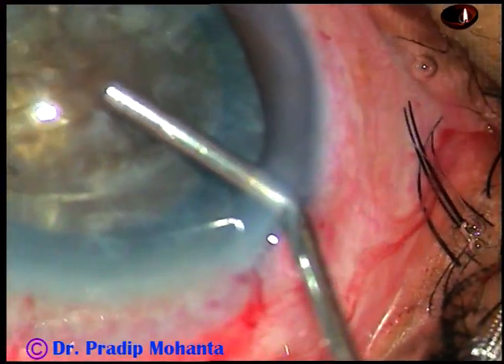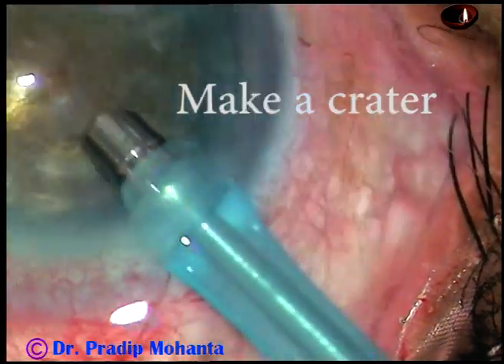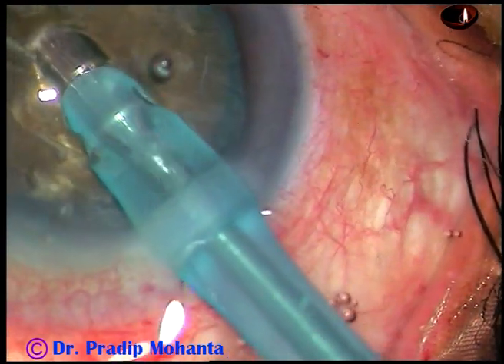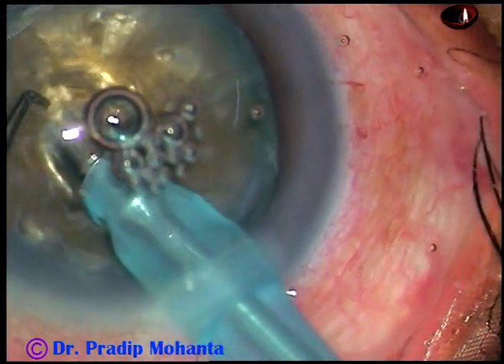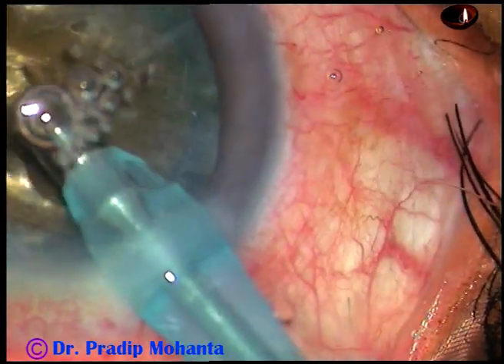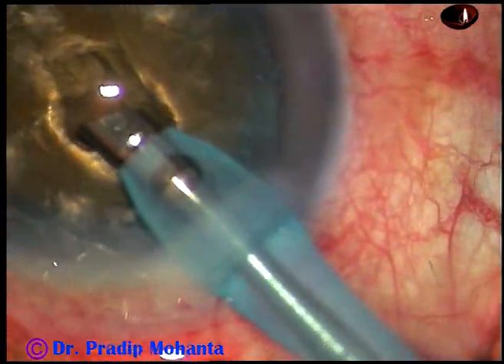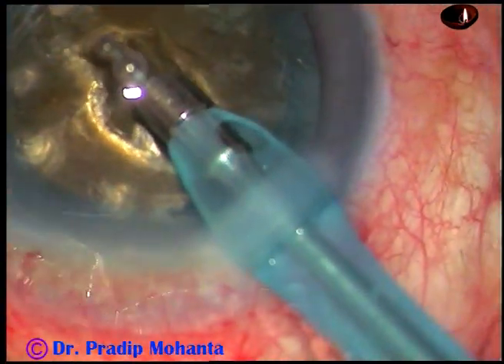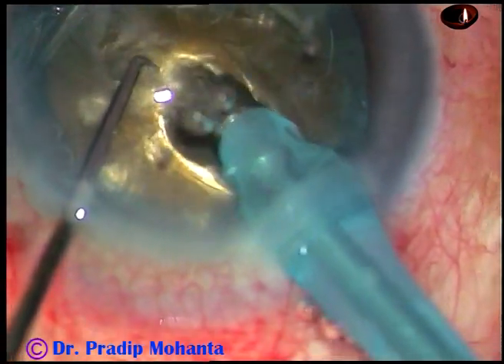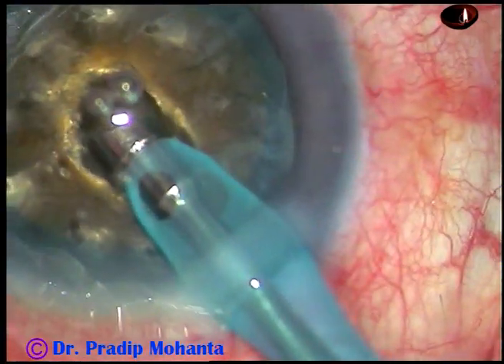Now I do hydrodissection and rotate the nucleus. After injecting viscoelastic substance, I have started to make a crater. In very hard cataracts where nuclear sclerosis is grade 5+ or grade 6, this is the preferred technique — you make a crater to debulk the central hard core of the nucleus, weakening it so it can be divided into fragments easily.